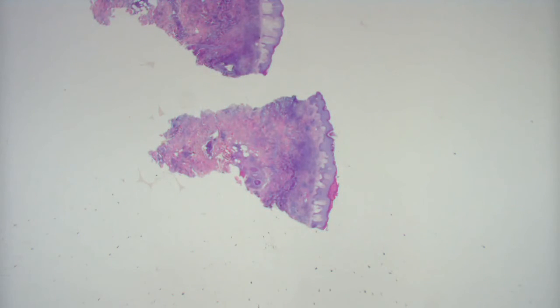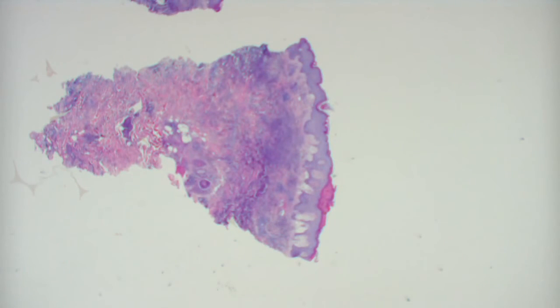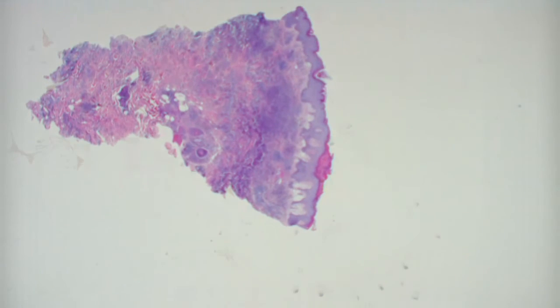All right, this is a punch biopsy with a very dense inflammatory infiltrate that's going deep. Lots of papillary dermal edema. It looks like there's a crust overlying it. What kind of cells are in it? Yeah, those are neutrophils. Why neutrophils at low power? At low power, they're very small, very dark, very basophilic. But not as dark as lymphocytes, right? No, not as dark. Some of these may be lymphs really.